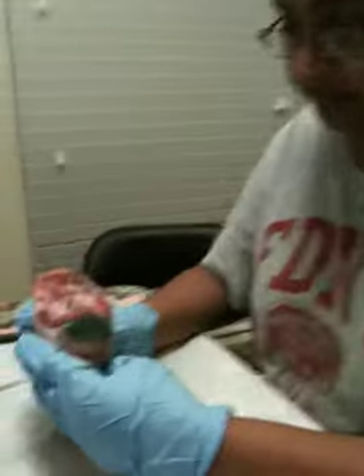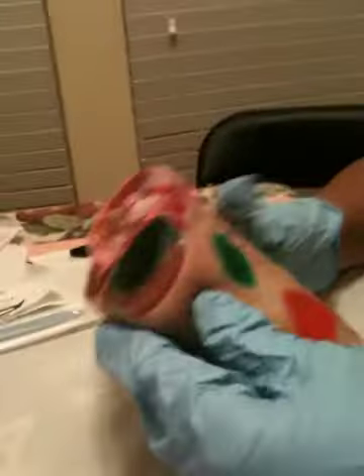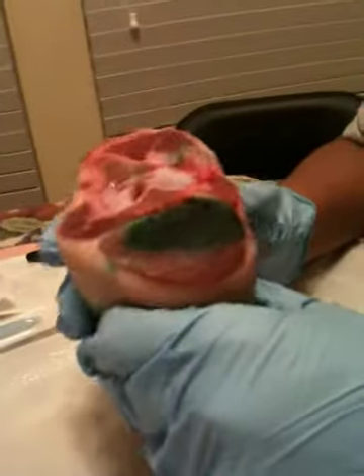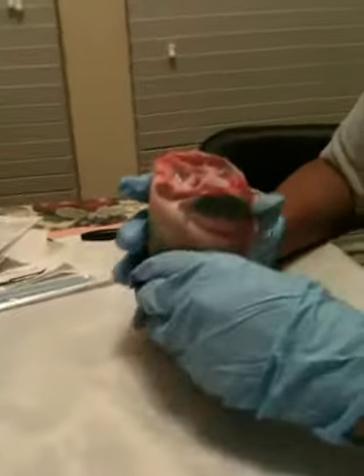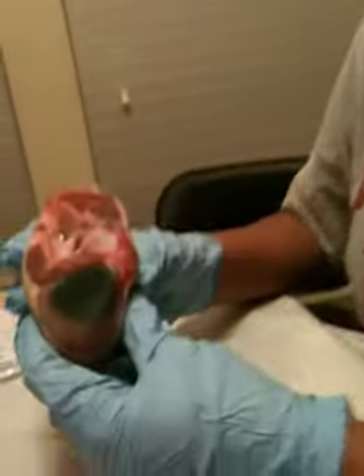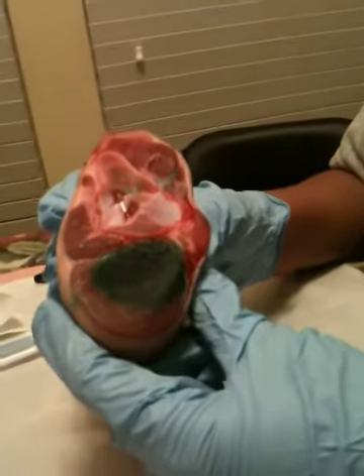My name is Preeti Mehta, and I'm going to be demonstrating my skills in relationship to the lab. So here I have the ham hock, which is dyed and ready to go. Here I have the area of the necrotic tissue, which has been dyed green.